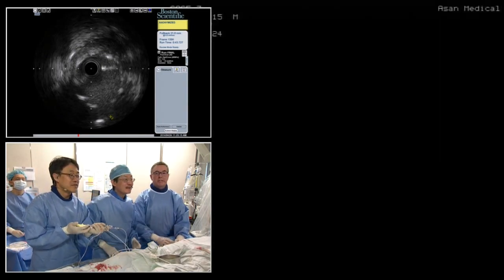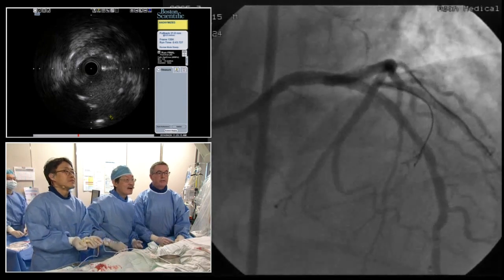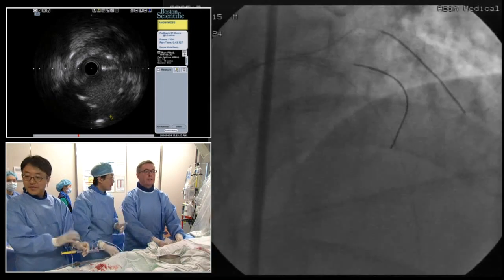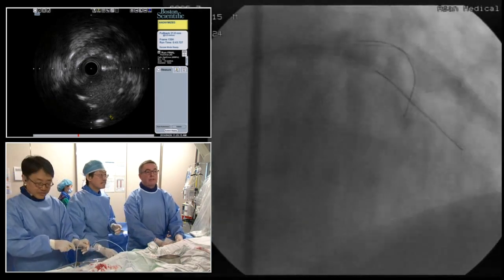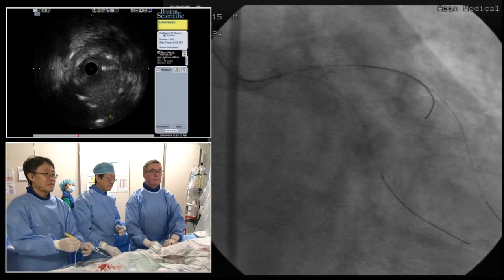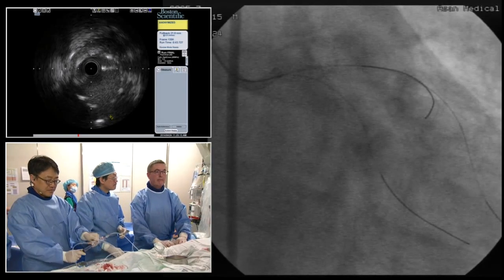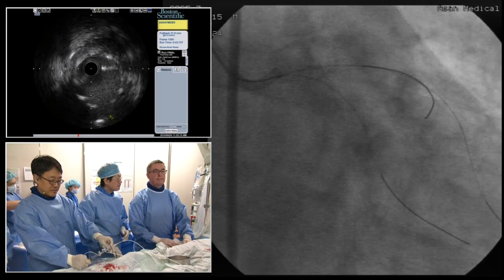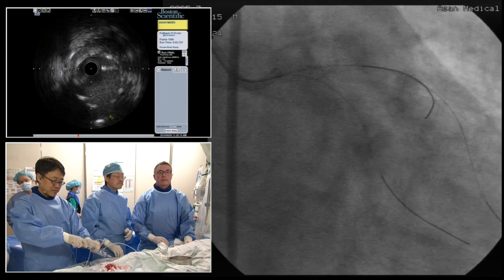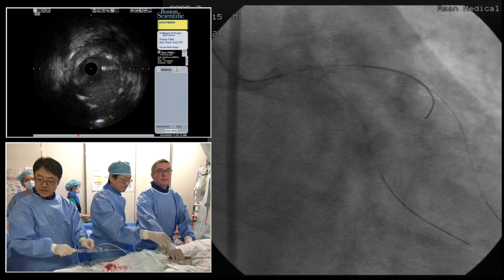And then the reality is length of the lesion is a critical determinant of resistance, which is something that's often overlooked. So when you get the angle correct again, just leave it there for a minute. I'll just move the wire down. But on the other hand, the IVUS in itself, if it is really a distortion of the anatomy with not much plaque, that also would give you a level of uncertainty. So it's difficult. As long as TIMI-3 flow, maybe I'll leave it alone.